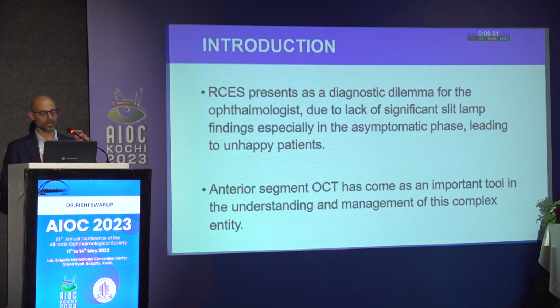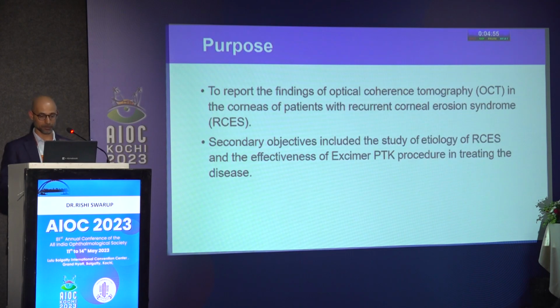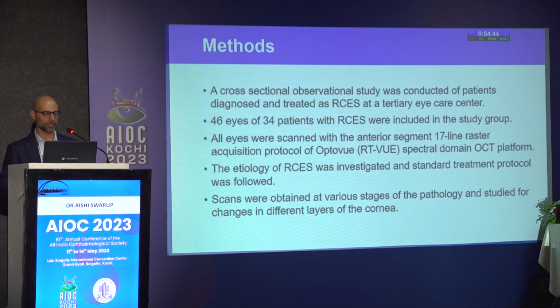And that's why I think having tools like the anterior segment OCT may be useful in helping us diagnose this complex entity better. So the purpose of this study is to report the findings of OCT in patients with RCE. The secondary objective was to study the etiology and also the effectiveness of excimer PTK.